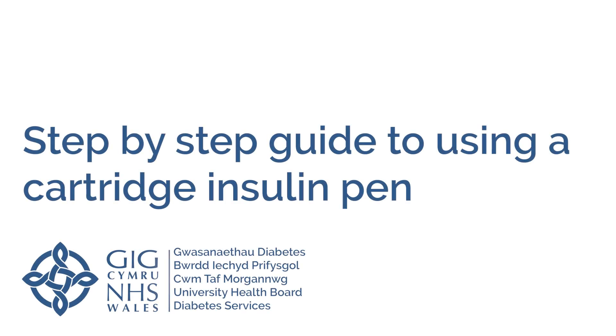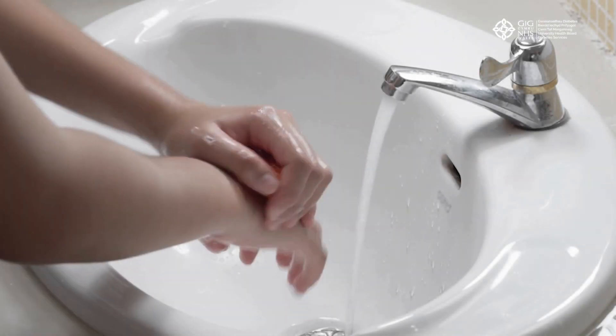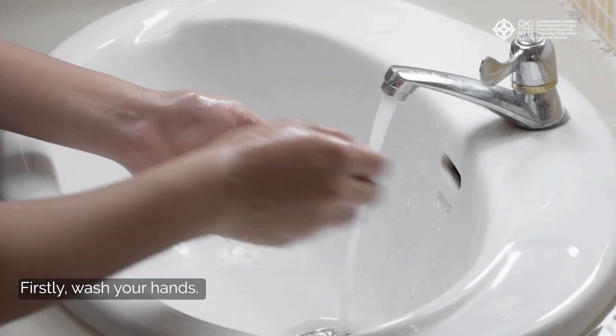Step-by-step guide to using a cartridge insulin pen. Firstly, wash your hands.